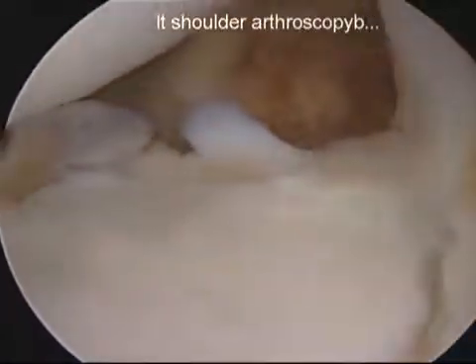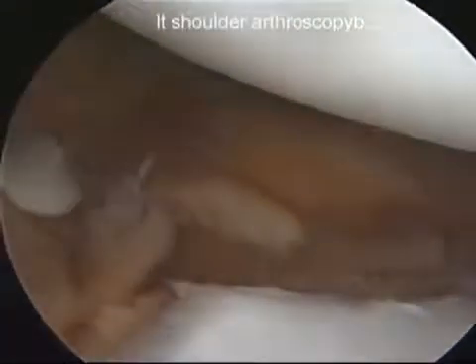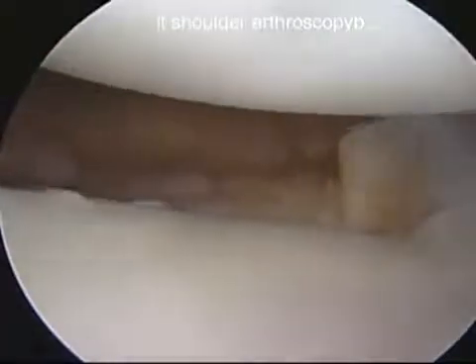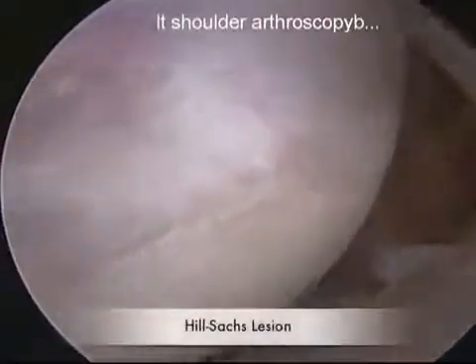The remainder of the superior and posterior labrum is intact. As the humeral head is elevated, anterior bone loss is appreciated. There is a small, shallow Hill-Sachs lesion present on the posterior aspect of the humeral head, and the undersurface of the rotator cuff is intact.